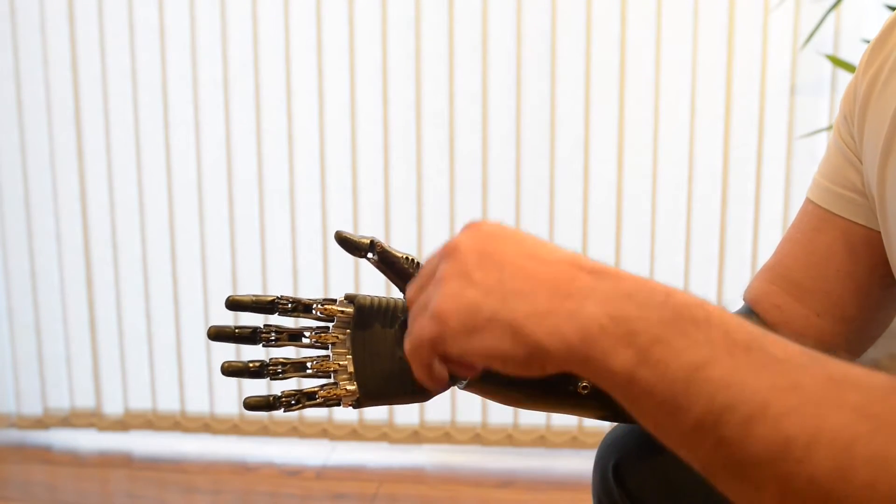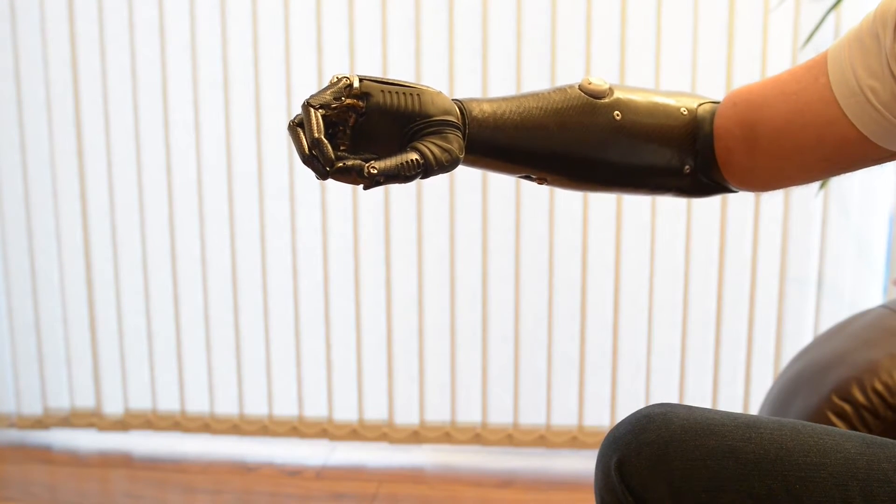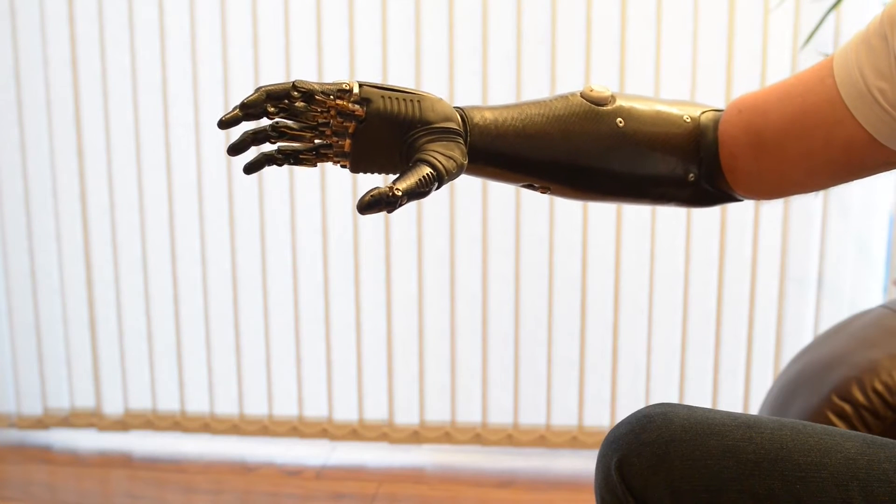This one will allow me to type on keyboards. We then move the thumb to this position and we can get a tripod grip — so pick up and put down small things.